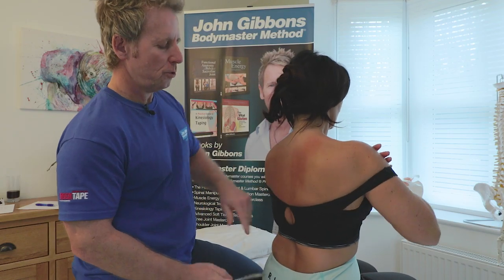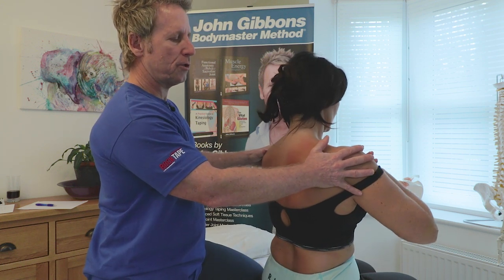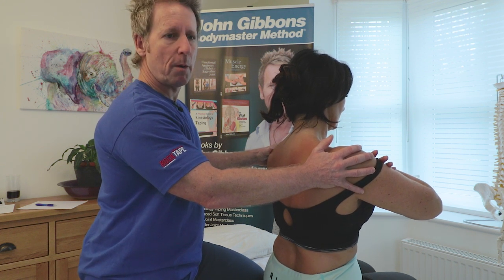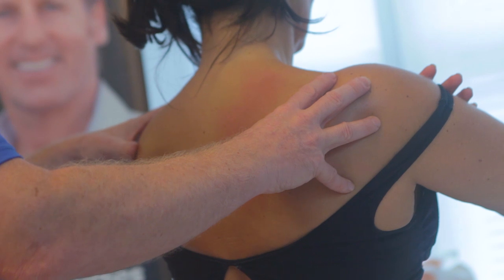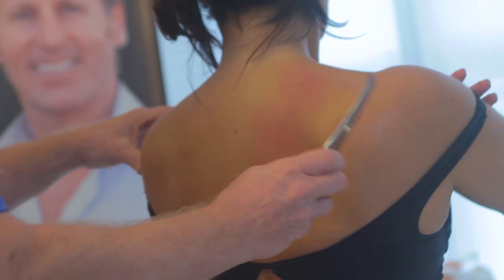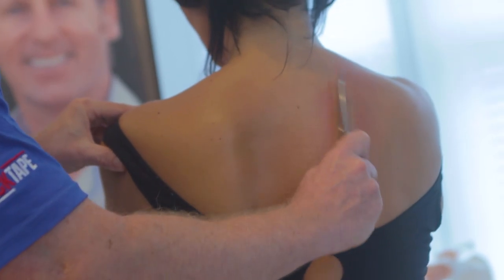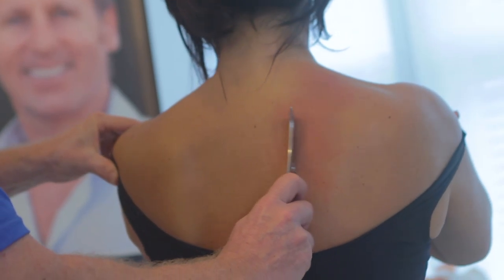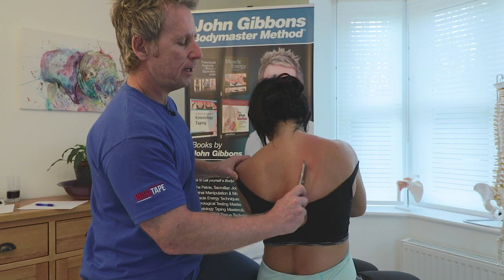If you want to, you can almost do a muscle energy technique. Ask the patient to rotate to the right, so my patient is pushing to the right. This is called a PIR — post isometric relaxation — 10 seconds is the ideal time. What we have now is a window of opportunity of 25 seconds because it's a relaxation process. The patient takes a breath in, breathes out, and then rotates to the left. My hand is guiding them — slightly passive, even though it's active by the patient — controlling the speed of rotation.